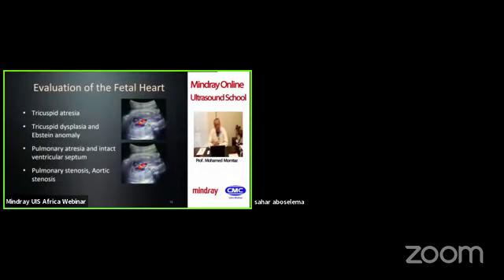Other uses of color flow, of course, each of them is a separate lecture, but I'll just give you a hint of the other uses of color flow Doppler in obstetrics. You can use it in evaluation of the fetal heart. As I said, fetal echocardiography has a lot to do with color flow and Doppler.